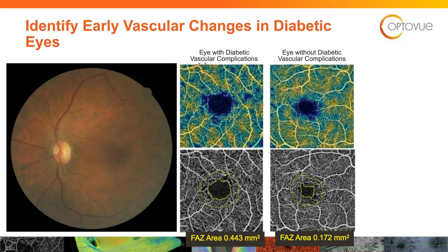And you can see it's measuring at 0.443 square millimeters. And if you just look at the yellow circles there and follow that donut ring around, if you look right at 12 o'clock, you'll see a little bright white spot there. Nice little microaneurysm popping out, and then as you go around that donut ring, you can see the black areas where there's actually capillary dropout.